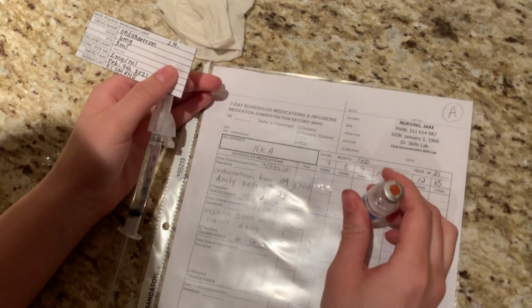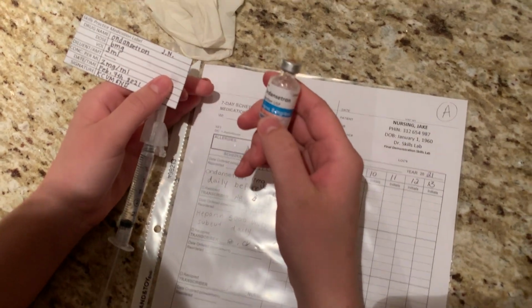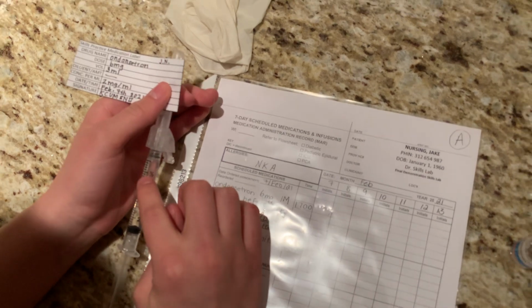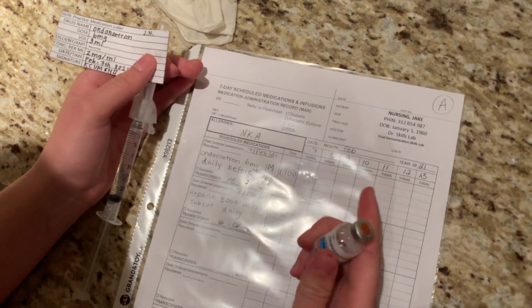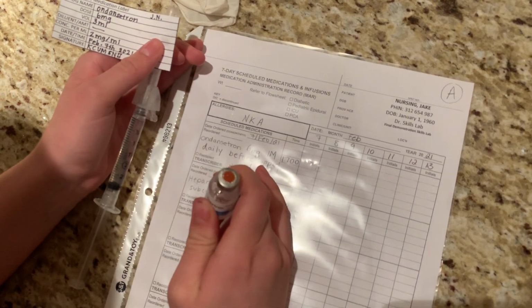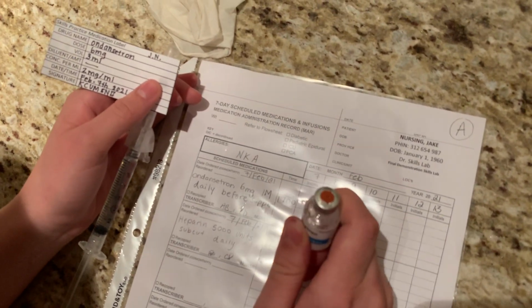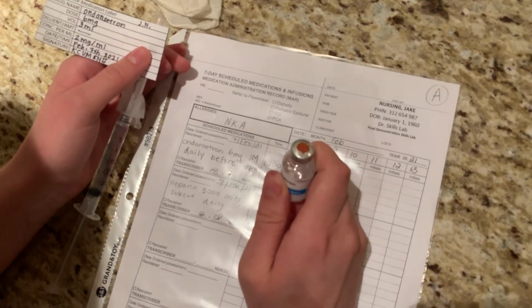So I'll do my second check, which is what I have here. Right route, intramuscular. This is an intramuscular medication. I've chosen the right needle and syringe for a ventrogluteal intramuscular injection. Right time and frequency, daily before supper. It's scheduled for 1700. It's 16:35 on the 7th, and no one's administered this medication, so I'm okay to give it.